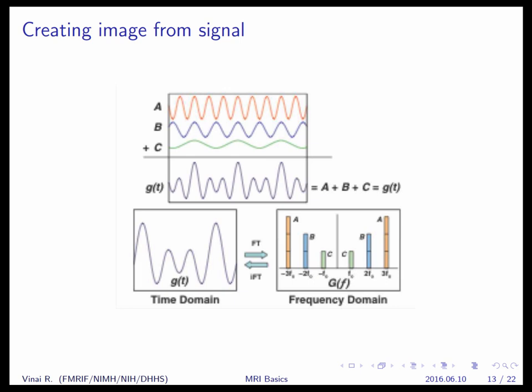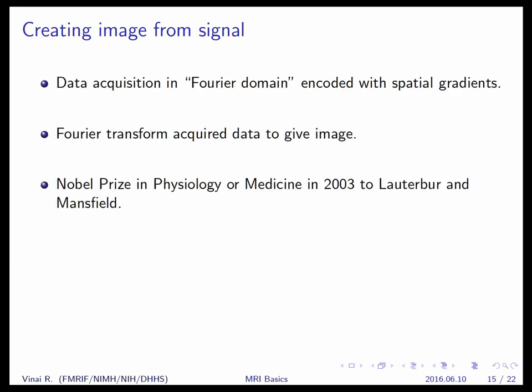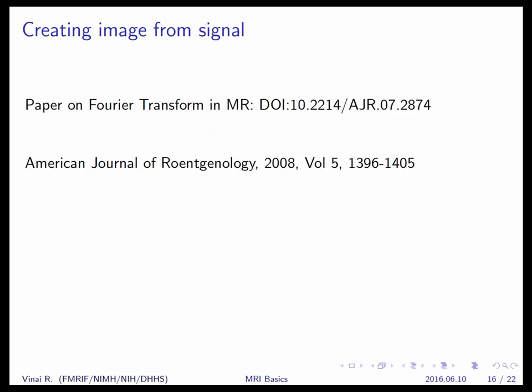Well, the outer parts are directly related to the spatial frequency. The edges. So if you cut off the outer parts of K-space, the image will get blurry. If you cut out the middle, it will just show the edges. That AGNR paper I talked about actually has some really nice examples of that. Then I'm just wondering how that translates into these individual frequencies.